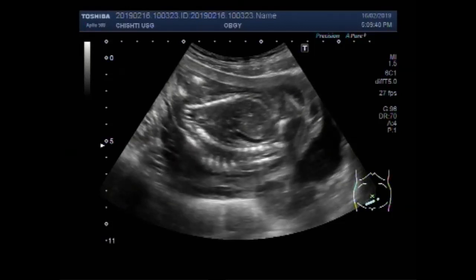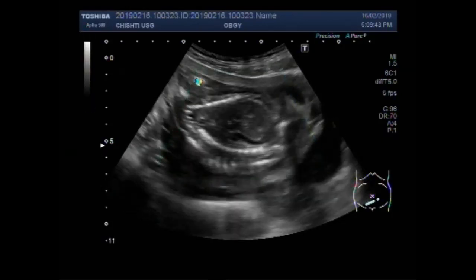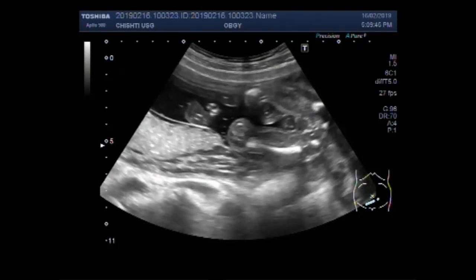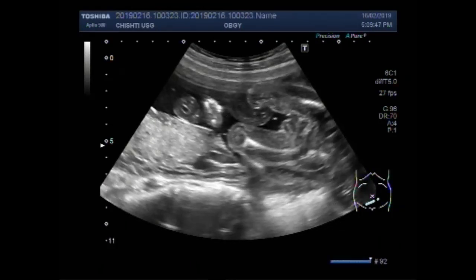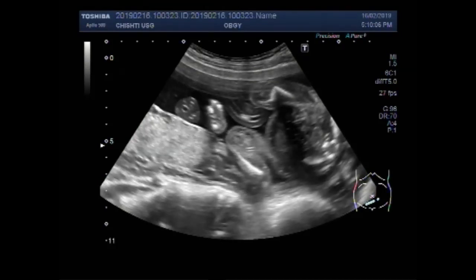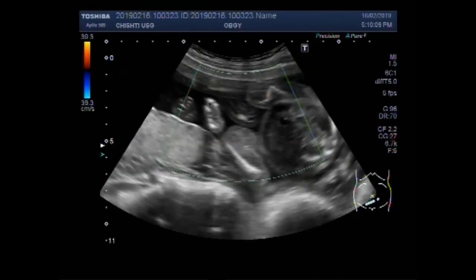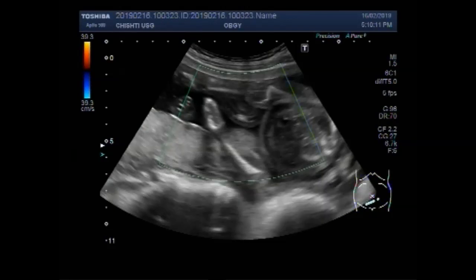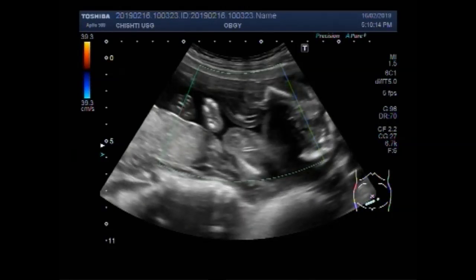Again you can see the fetal abdomen — no blood flow, no cardiac activity. This is the umbilical cord, a portion of the umbilical cord. No fetal limb movements are seen. No blood flow is seen.